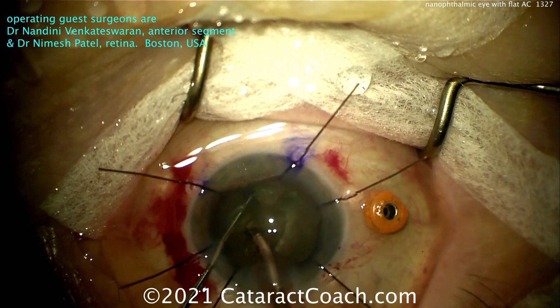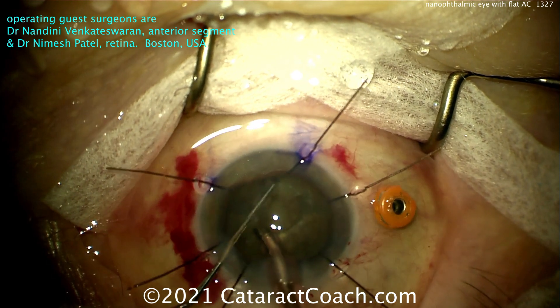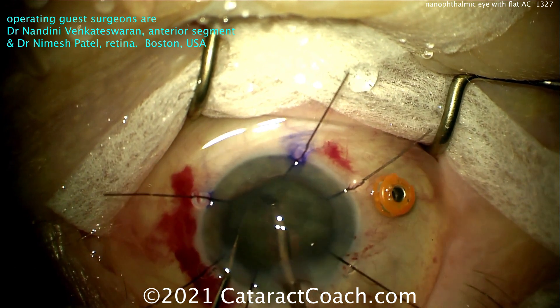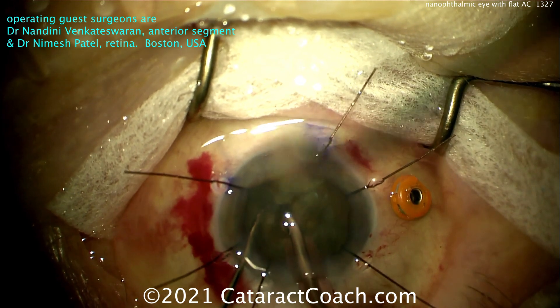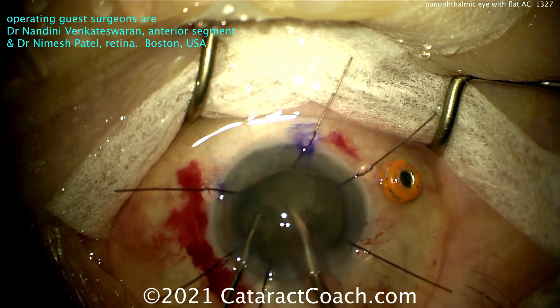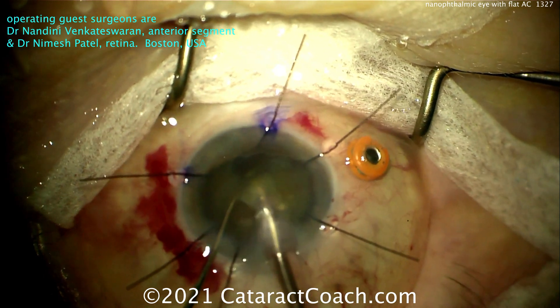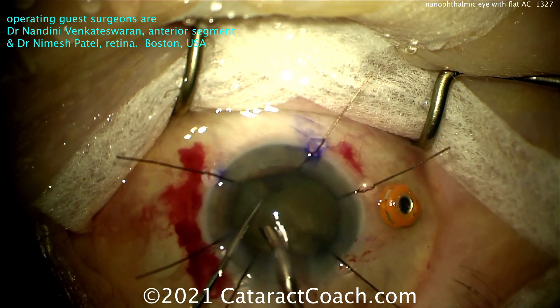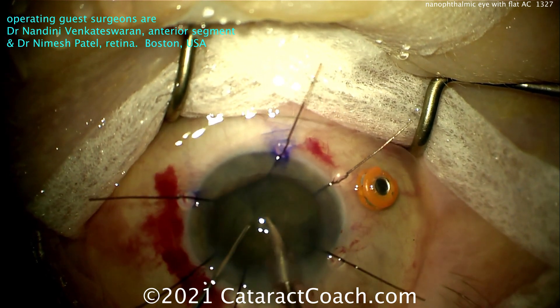We're going to take out these pieces. Really nice work from these two young surgeons — up-and-coming faculty members at Harvard — doing a beautiful case to help this patient. We'll see a beautiful result at the end. Slow it down. I'd even slow down the flow rate on this case. Don't be in a hurry. Those iris hooks in this case are actually better than a pupil expansion ring. Why is that?